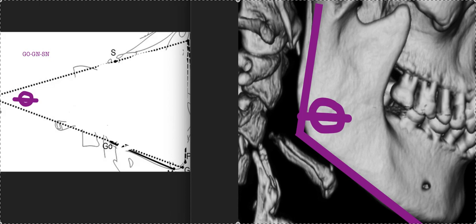The question was, will a gonial angle change with palatal expansion? The gonial angle is the angle of the ramus right here, this theta.